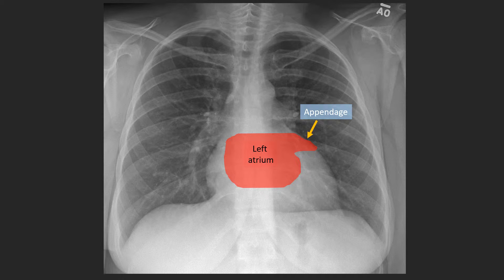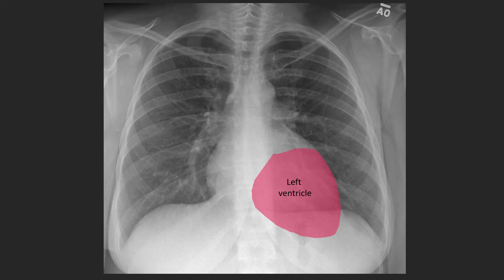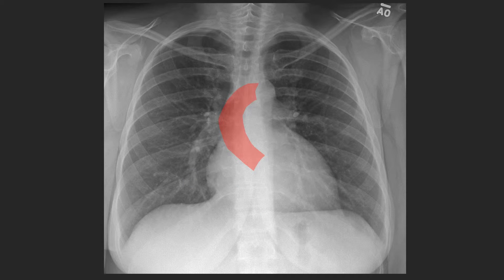Blood leaves the left atrium via the mitral valve, seen in purple, which is roughly at the same latitude as the tricuspid valve but more laterally to the left — remember the tricuspid valve overlies the spine. Blood is now in the left ventricle, normally the largest and thickest chamber, which forms the majority of the left cardiac contour. Blood then leaves via the aortic valve, seen here in yellow, which is located at the dead center of the heart, slightly higher than the mitral and tricuspid valve planes, just off midline to the left, and oriented toward the left shoulder.